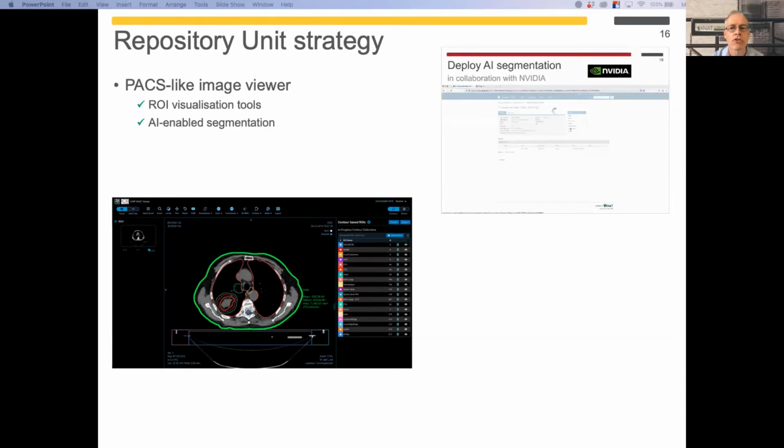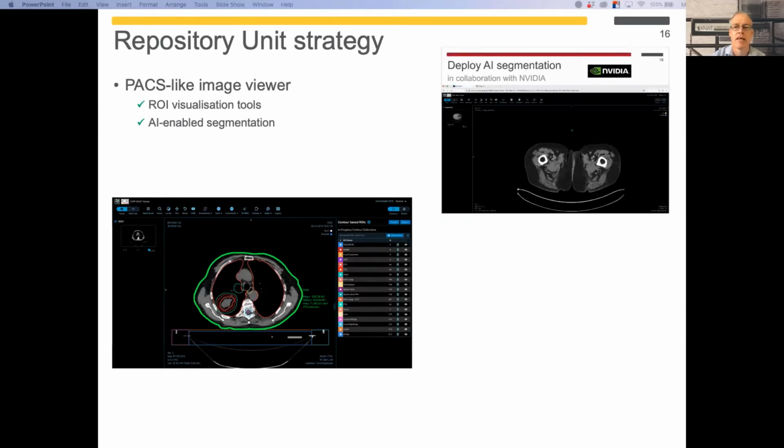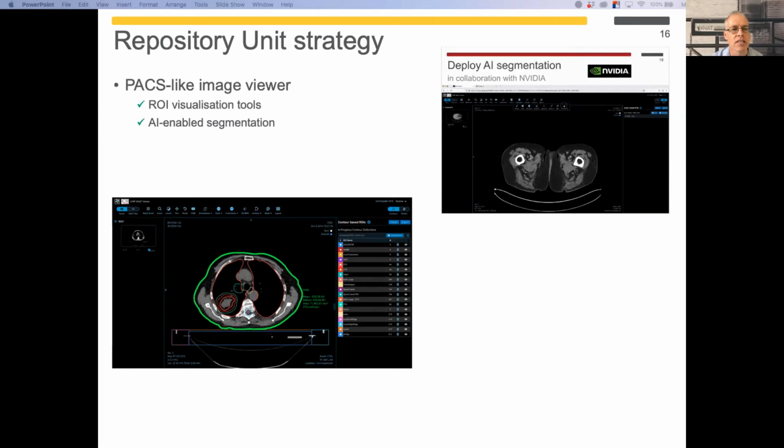Ramona and Lorena have already talked quite a lot about the NVIDIA AI annotation. This is an experimental feature in the latest released version of the XNAT OHIF viewer integration, which comes as an XNAT plugin. But you have to add in an AIAA server to be the thing that XNAT and OHIF communicate with. And there's a nice video in the new training course that we're launching that steps you through exactly the procedures you need to install that NVIDIA server.